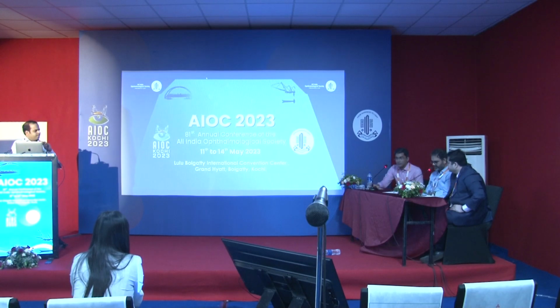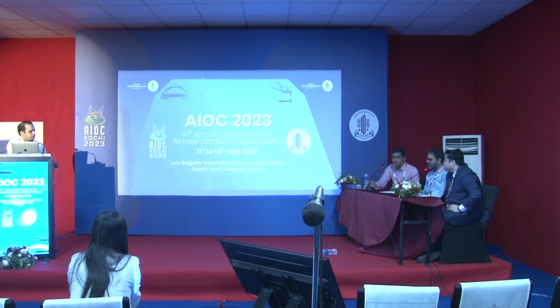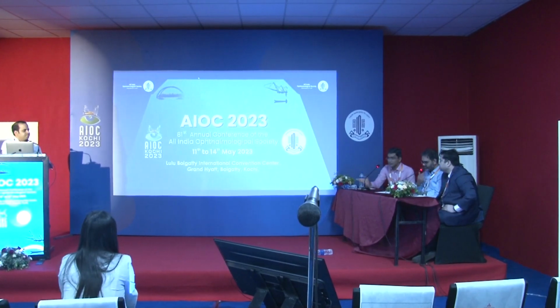One more thing I would have wanted to do was peel the ILM and not do laser at the site of that drainage retinotomy, because once you peel the ILM, the chances of detachment are very low. As you could see, after the laser the retina also gets thinned out. We could have added laser post-op with a focal barrage kind of approach with a little more control, because whenever we use laser intra-op, the distance and the power are completely different, and the scarring is different. But fantastic.